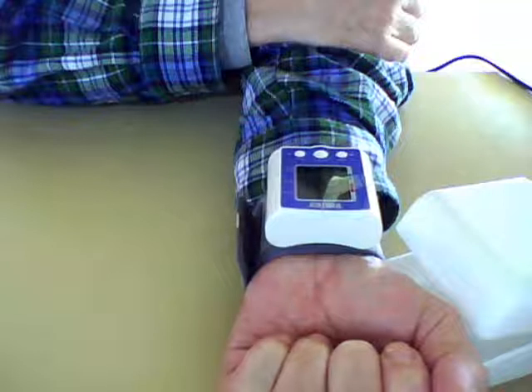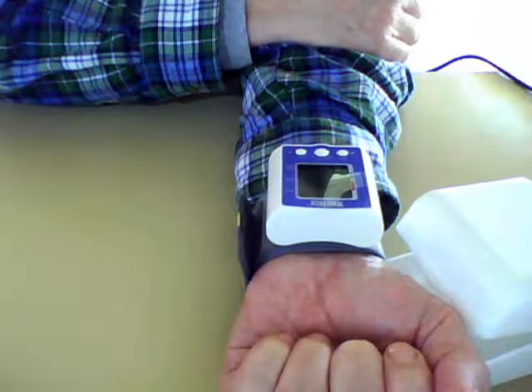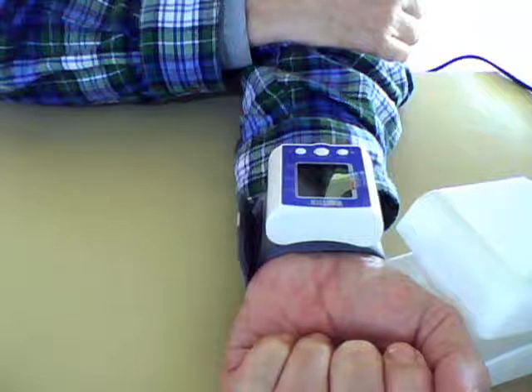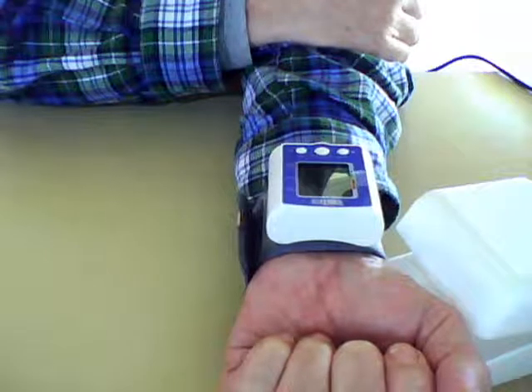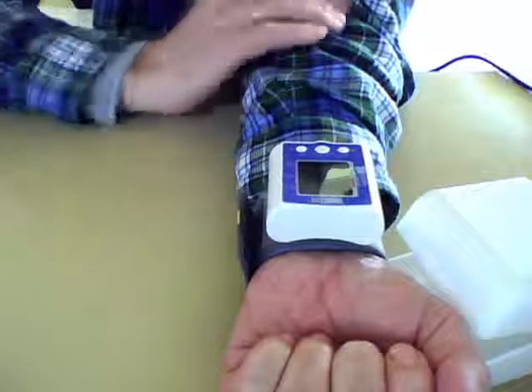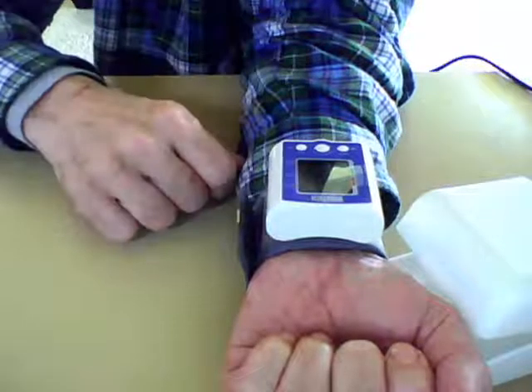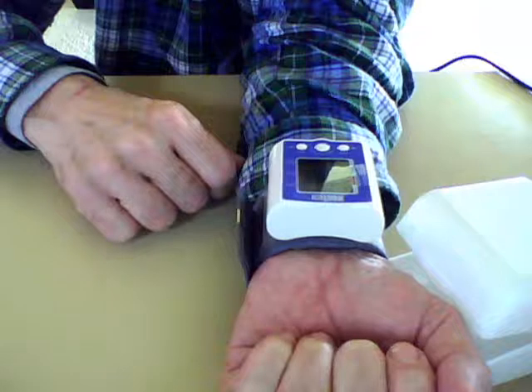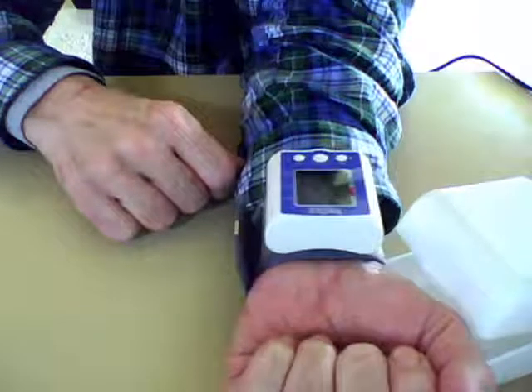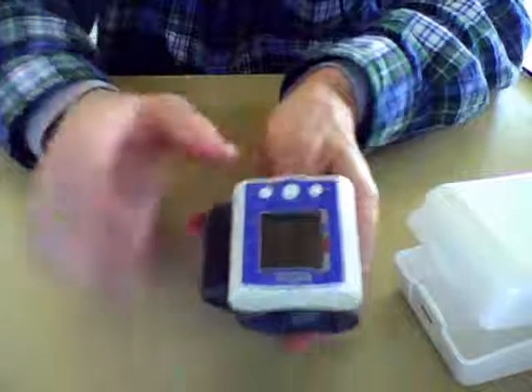I just came back from a bicycle ride, so my blood pressure's probably going to be a little high, maybe not. Of course, you don't want to place your hand over your arm and cut your blood supply off while you're taking your pressure. 106 over 77. Pulse is at 80. Slip it off and hit the button, turn it off.